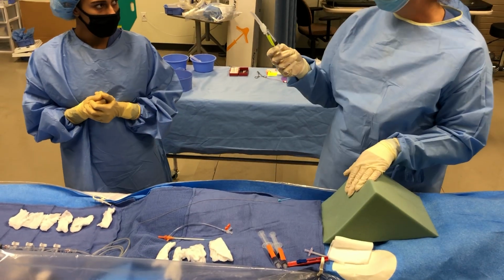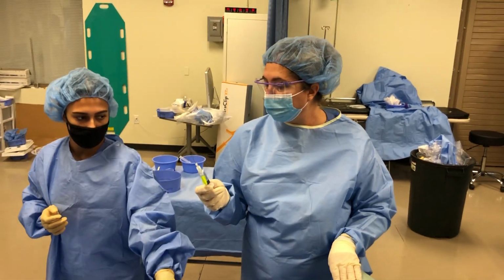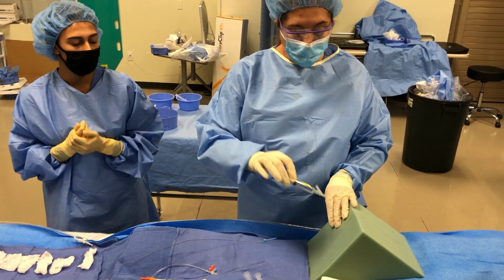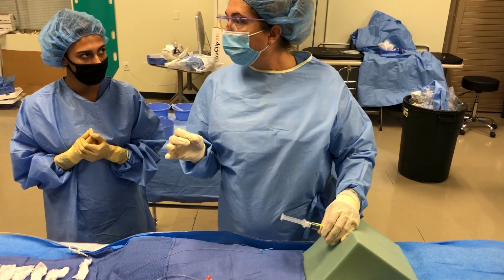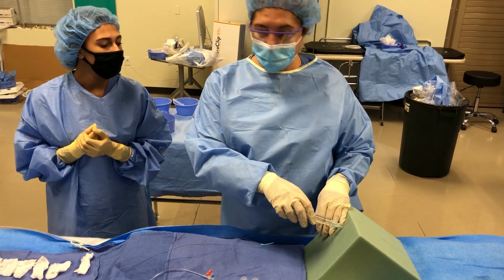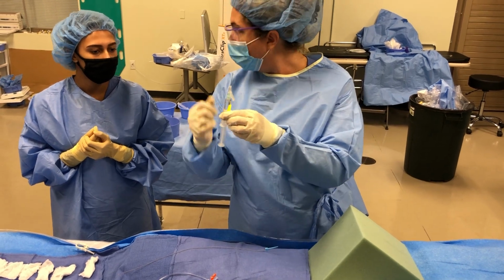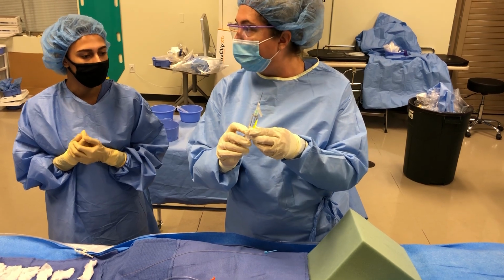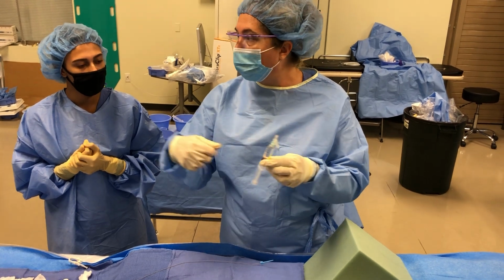Okay, next step is going to be my deeper lidocaine. Okay, with this one, I'm going to go in. Now this is where it's a little different. The doctor needs to aspirate a little bit. And I had a good question, well, if we filled the syringe up, how are we gonna aspirate? You're not gonna fill it completely to the hub where you can't pull back at all. I did say fill it, but I want you to fill it to about 10. Now this is a 12. You're still gonna have a couple cc's where they can still pull back.